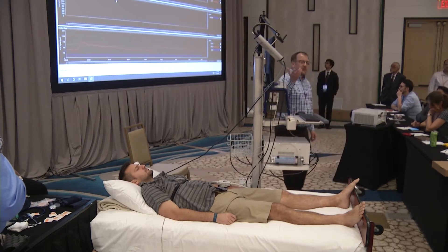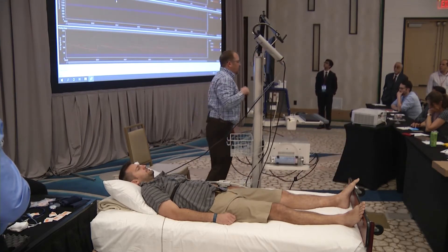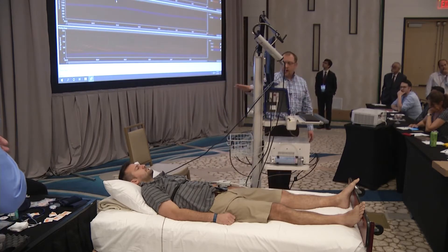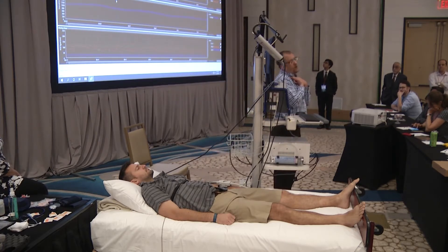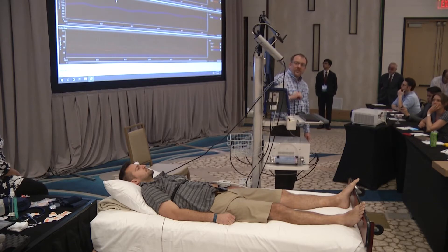I positioned the device up here, which is going to give us our breathing cue and also the cue for the Valsalva maneuver, positioned over the patient. One thing we don't want is to have him moving his neck around a lot after the Valsalva. We want to make sure that's in a position where he's not moving around, since we're also looking at the baroreceptors in the neck with this test.